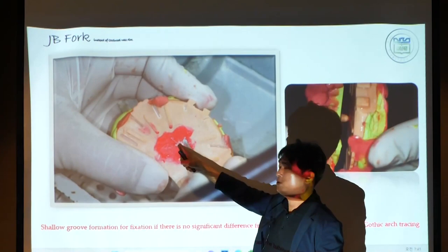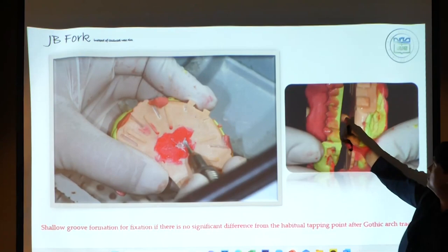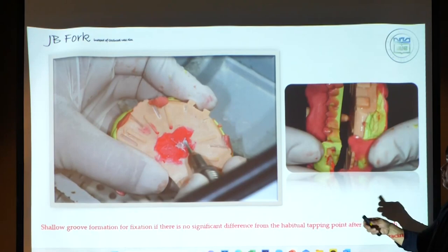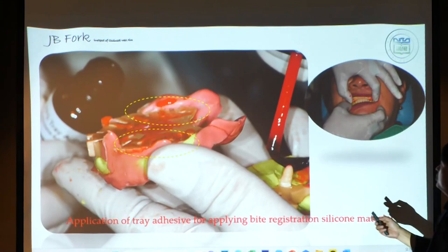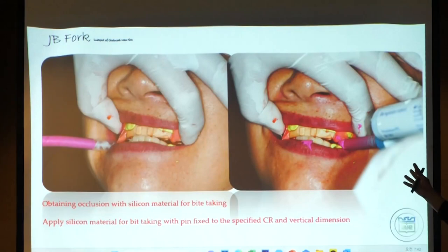This punch, this shallow groove, is for fixation of the upper and lower plate. The patient bites on this part and then doesn't move. They don't move. Okay. And then silicone adhesive application, and then inject the bite material. You know. So, let's finish it.